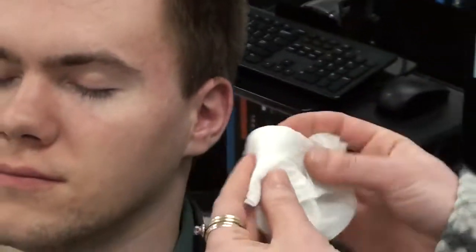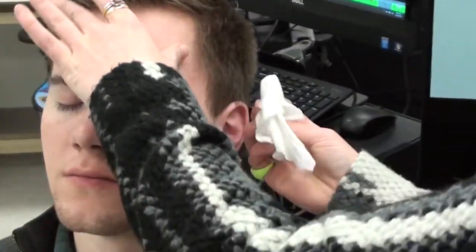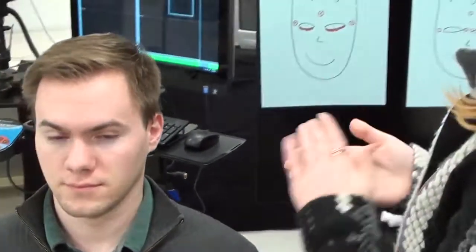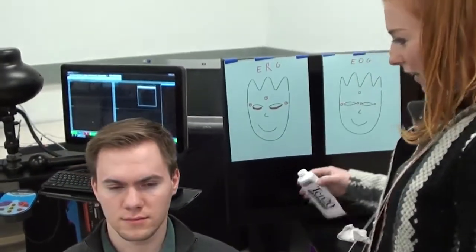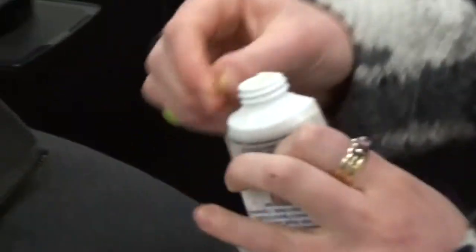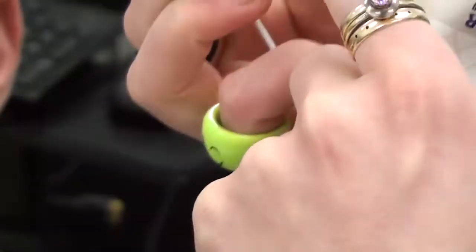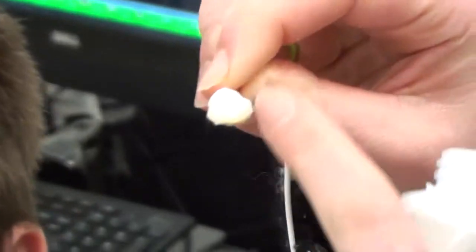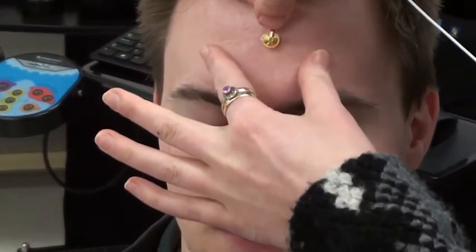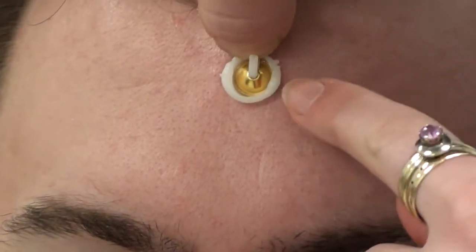Once you're happy that it's clean, you remove the lemon prep and put that off to the side. Now we're ready to apply an electrode. We take the gold cup and dip it in the conductive paste so that it fills the inside and there's some overlapping over the top. Then we place it onto the skin.